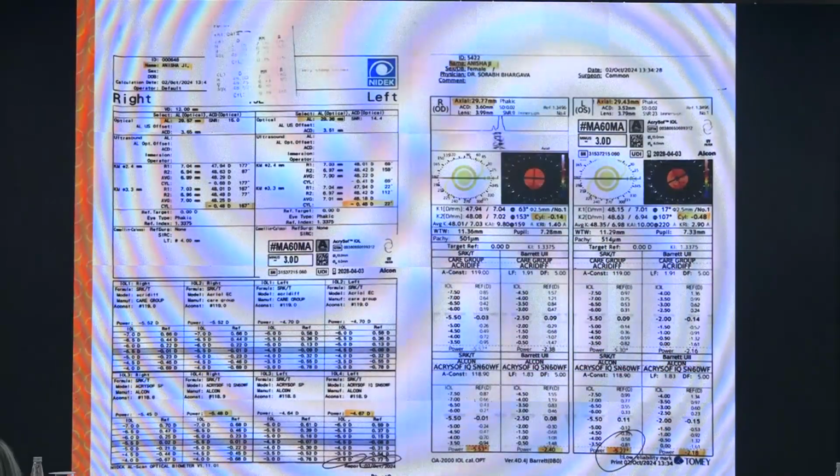Here, what I need to emphasize is, this is a case, a young lady having an axial length of about 29.6 millimeters. And here, I've put two different biometries side by side to emphasize that though SRK/T is accurate, you need to have the Barrett Universal 2. So here, the power was coming with Barrett's U2 minus 2.18. And that was pretty accurate when I went ahead with the surgery of this case.